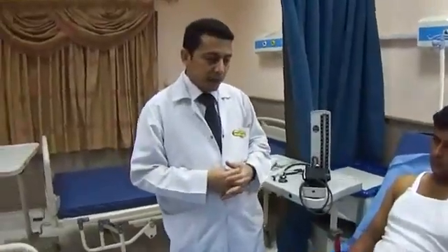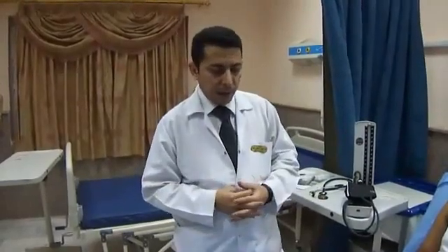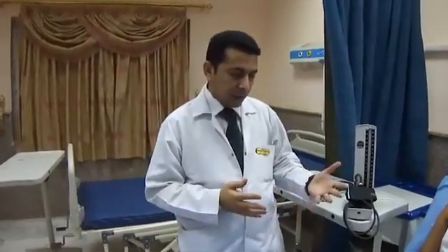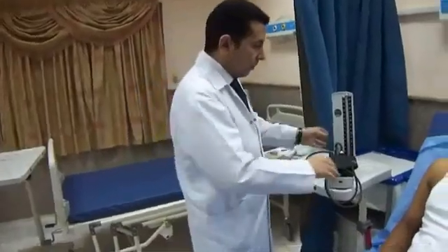Those who are younger than 35 years should also have blood pressure measured in the legs. For elderly patients, or those with autonomic dysfunction or suspected hypovolemia, the examiner should also measure blood pressure in the supine position and in the standing position, searching for postural hypotension.